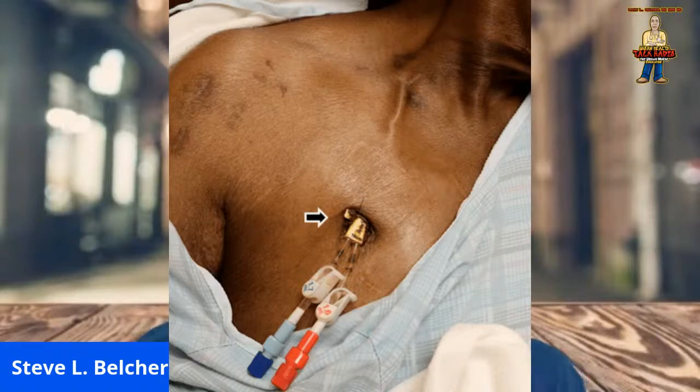Now, how many warriors with catheters have been told, we have to turn your blood flow rate down because your machine kept going off, and the only way they can keep your machine from going off is to reduce your blood flow rate? I know, because I had to do it myself, guys. If this occurs for more than one treatment in a week, the catheter should be checked. The lower blood flow rate will cause you to receive less dialysis. You will then need a longer than usual hemodialysis treatment to get the proper amount of dialysis.